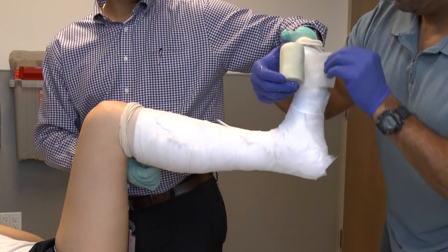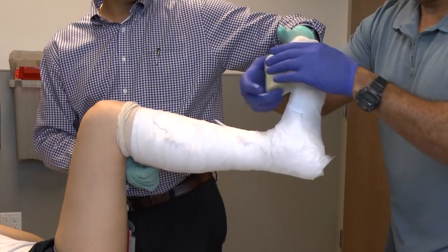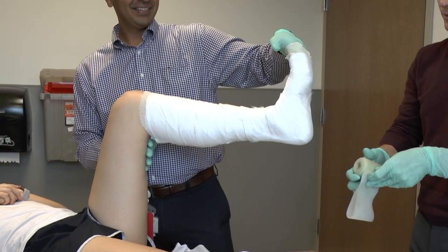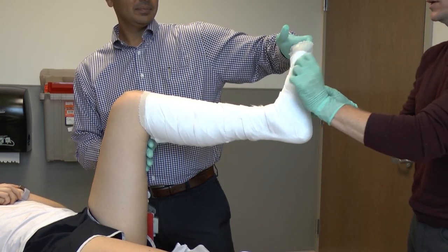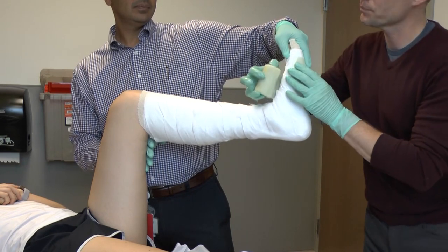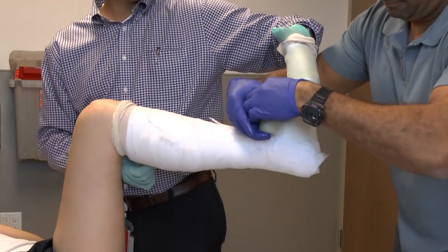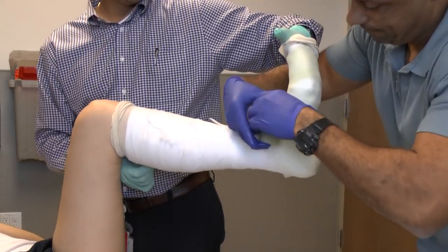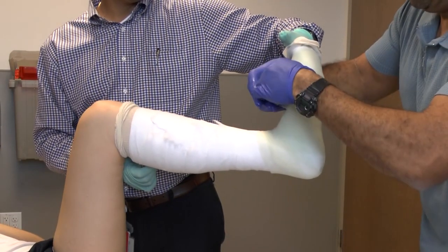When using the fiberglass, it's important to make sure it is wet but not very damp. Application begins by wrapping around the toes to reinforce the toe plate. One method is to create a small reinforcement splint and then start wrapping around the toes. As you place the fiberglass at the toes, use a slightly oblique placement so that it is longer at the big toe and shorter at the small toe.